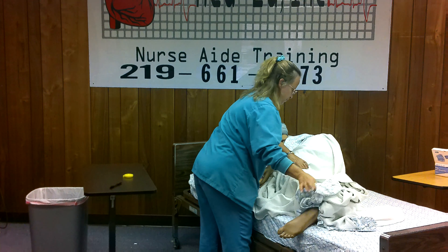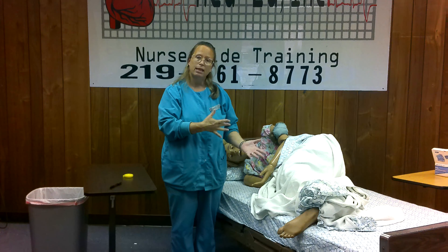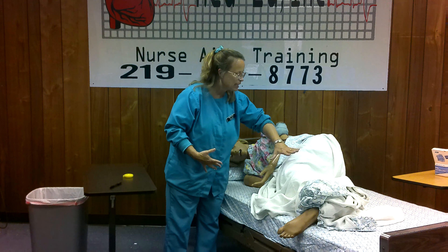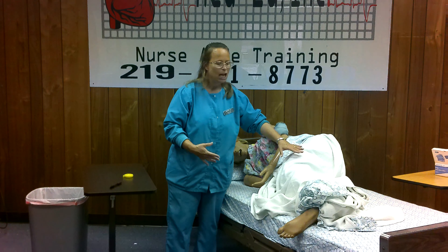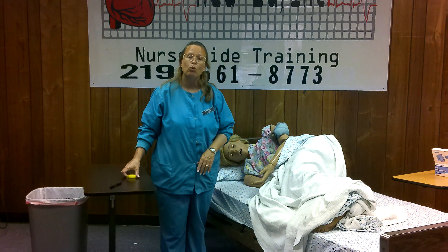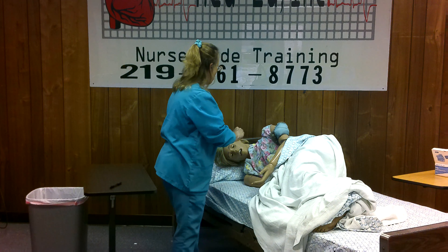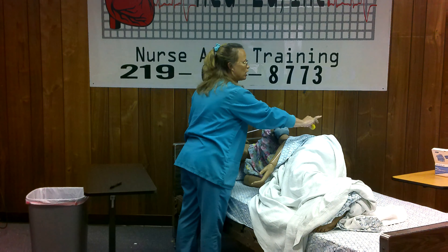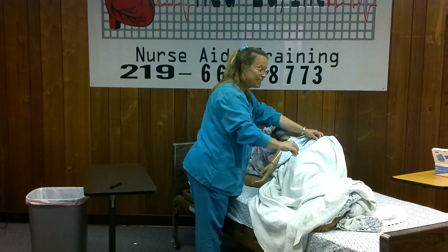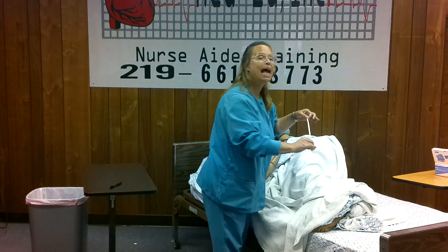There are all different types of contractures, but in this scenario the resident's arm is contracted and the resident's leg is contracted, so the resident is unable to straighten out. If you have a resident that's contracted, take your tape measure. We're going to start at the top of the head, measure down to the hip, and write it down. Measure from the hip to the knee, write it down. Then measure from the knee to the heel, and write it down.